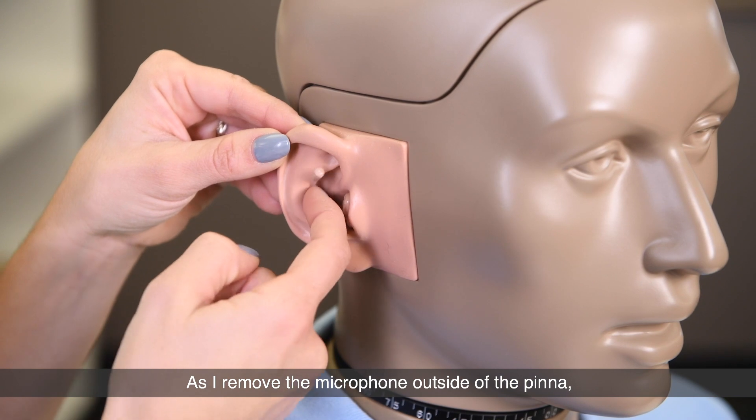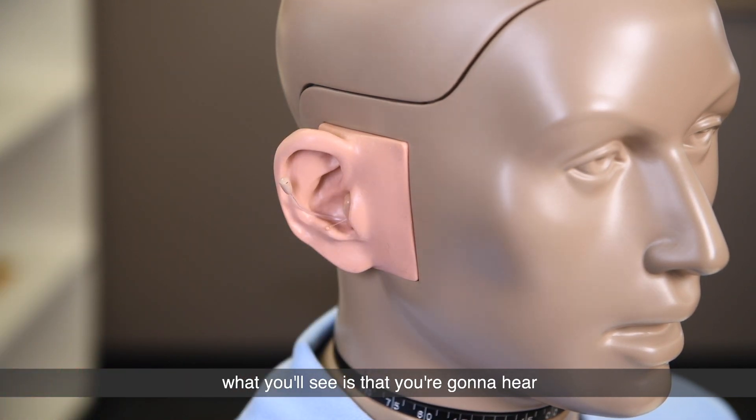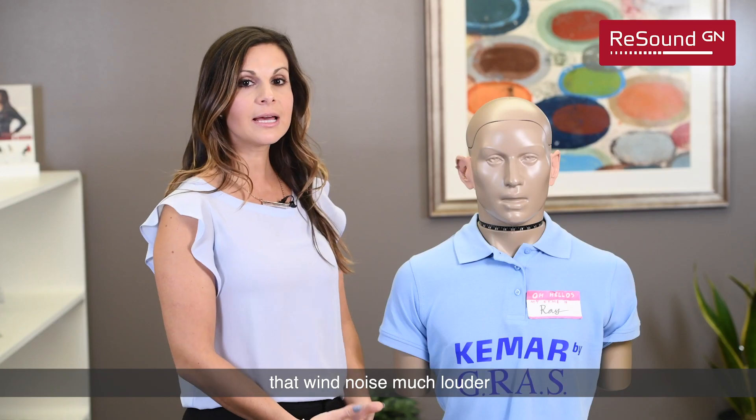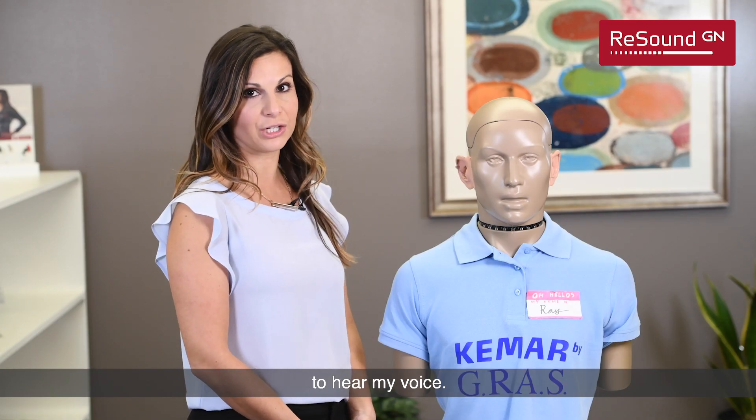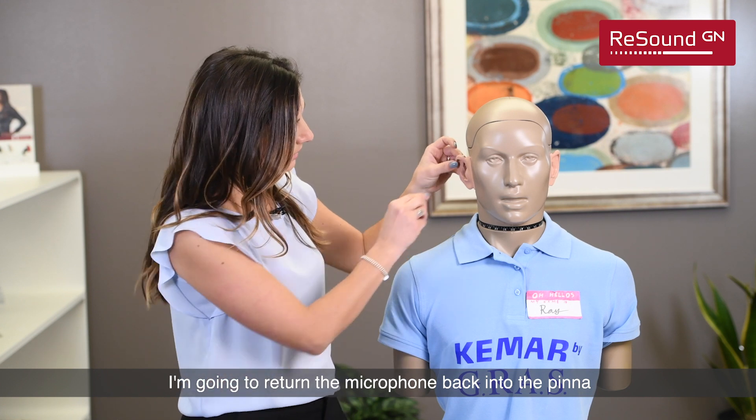As I remove the microphone outside of the pinna, what you'll see is that you're going to hear that wind noise much louder and it'll likely be more difficult to hear my voice. I'm going to return the microphone back into the pinna.